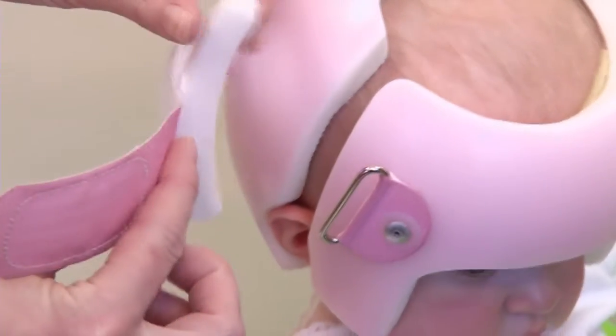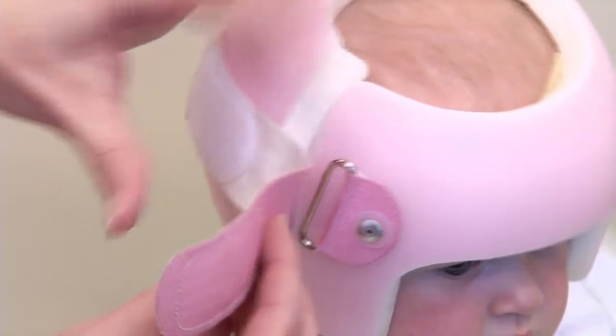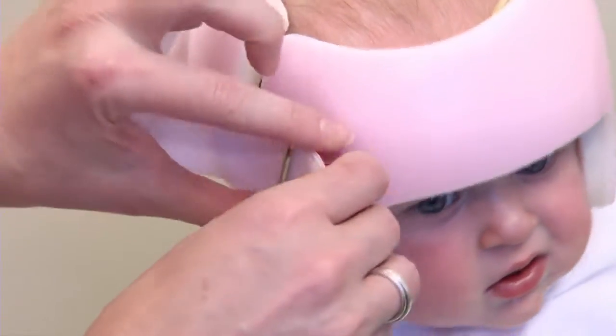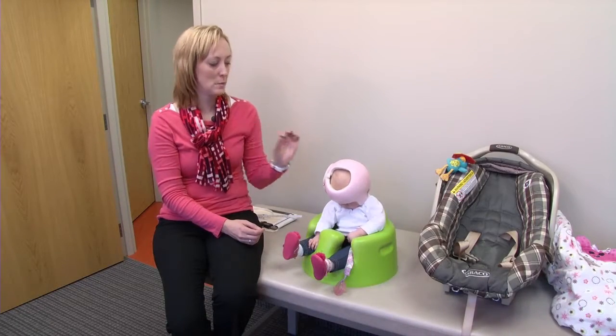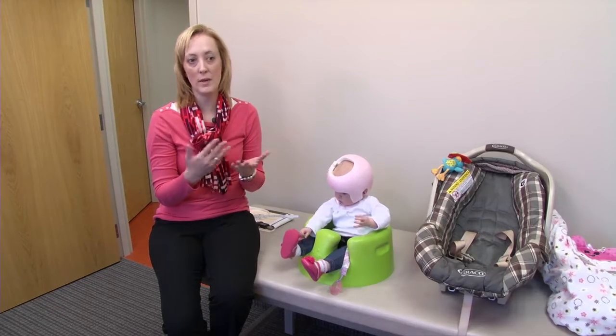The strap on the side of the helmet and the spacer are there so that you can tighten the helmet and keep it in place. Pull the strap gently so that the slack is removed from the side — never pull tightly. You want to make sure that the spacer is always attached to the strap and doesn't come off.